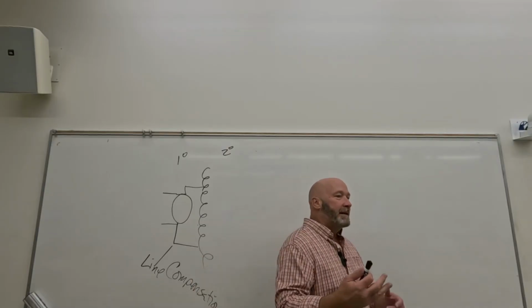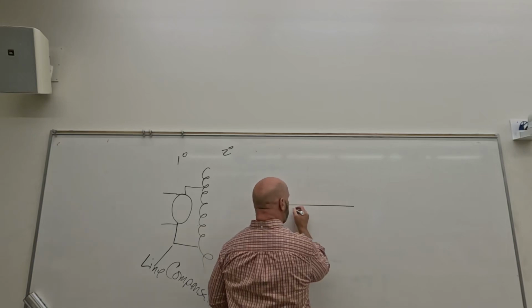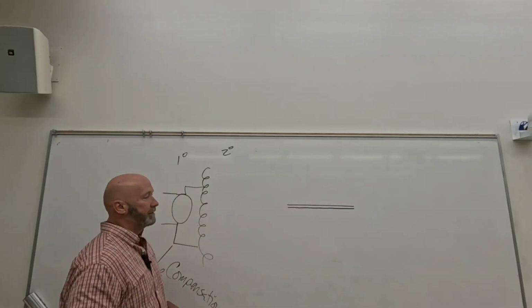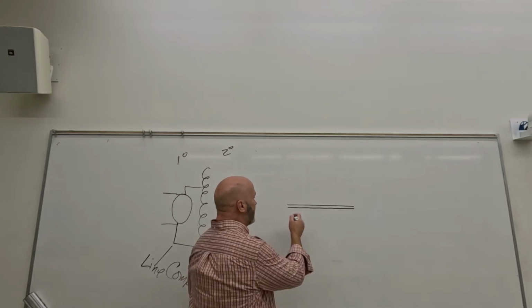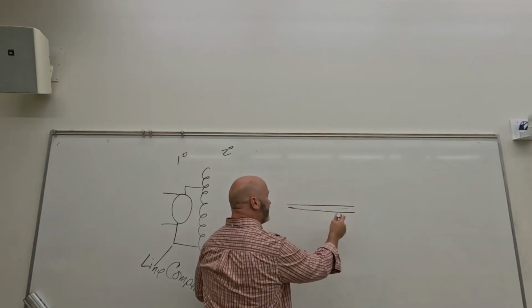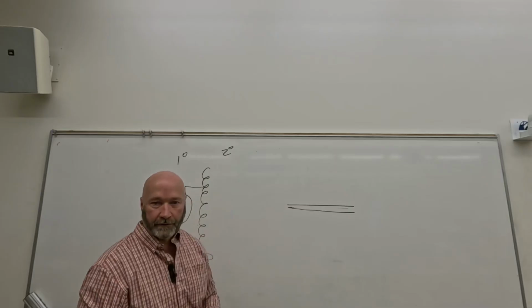The same thing could potentially happen if our tabletop, instead of being of uniform thickness, those lines are supposed to be perfectly parallel to each other. If they're not of uniform thickness, let's say they're fat at one side and not so fat at the other side, then this end is going to absorb more x-rays than this end, even if it's radiolucent.